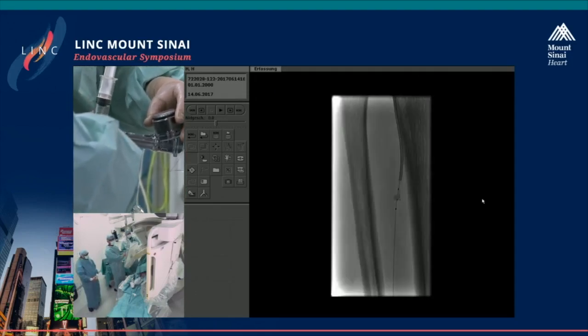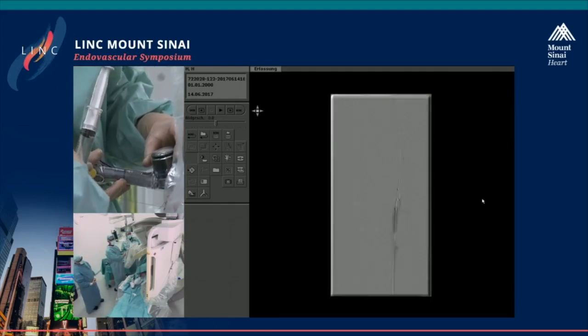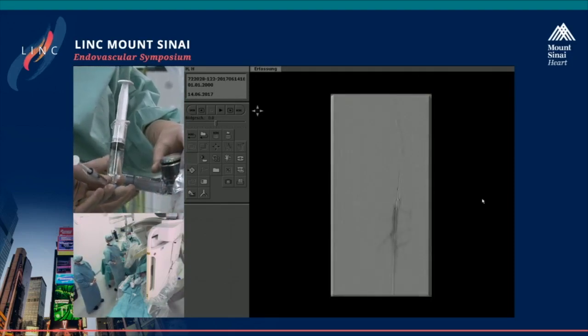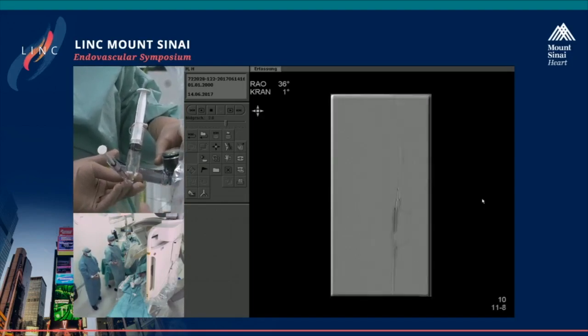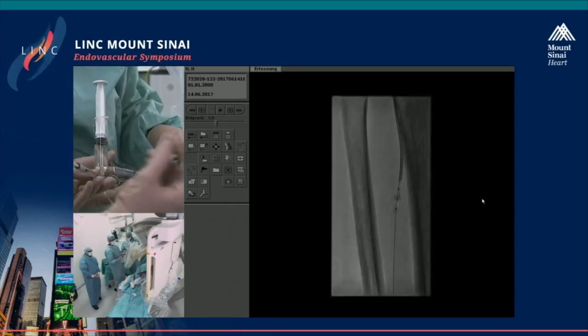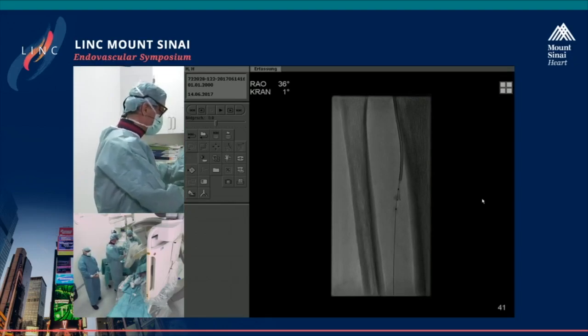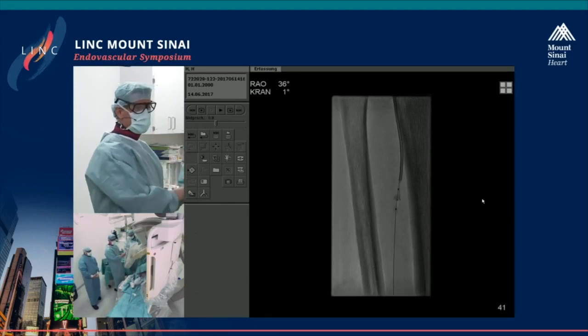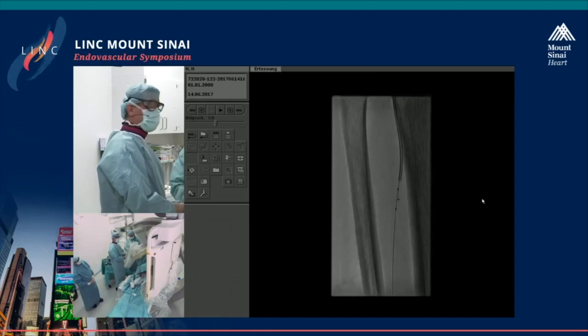The first injection is, we take something like 0.5 milliliter in. We do it with DSA. Sometimes the needle doesn't really go into the arterial wall because we hit maybe an area where the arterial wall is too calcified, as here. You can see here that now the dexamethasone, which is mixed a little bit with contrast, does not go into the arterial wall, into the surrounding tissue, but goes downwards. So that means this needle obviously just now did not hit or go through.